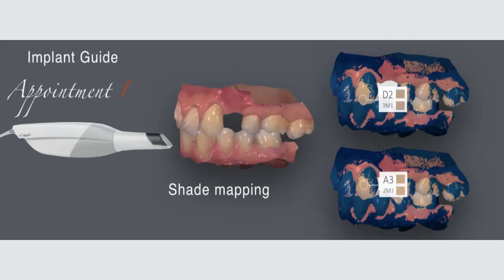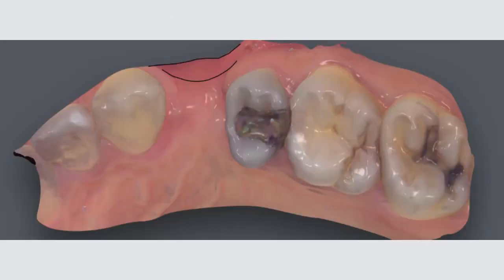Let's go to implant case 2, which tracks the same thing in different concepts. Not only do you scan the patient at the beginning, but using the scanner, especially, you can really map shades and see how you can match shades. It's a single implant that is missing. I could graft the tissue here on the top. The patient was not willing to graft any tissue. The patient would like to place an implant if possible. If grafting is in the scope, I would graft first and then place the implant. But anyway, this is the proposal that we have given.